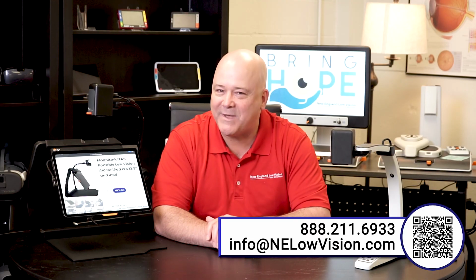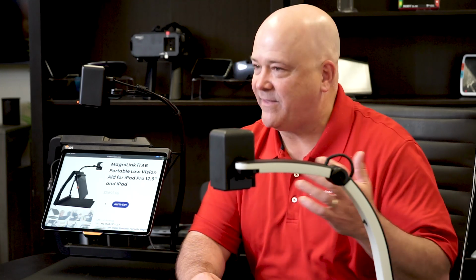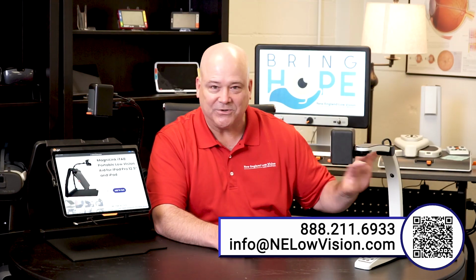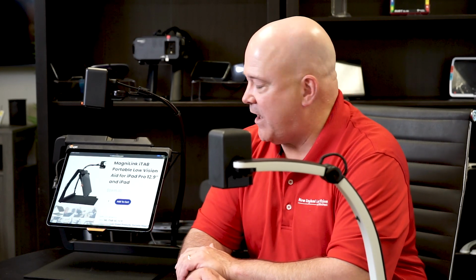Now there are some minimum specifications which we're going to put on the product page of both the iTab and the MagniLink S that you need to have for your iPad, so it won't work with the older devices, but these newer iPads, it's a really nice addition to the family of the MagniLink Tab systems.